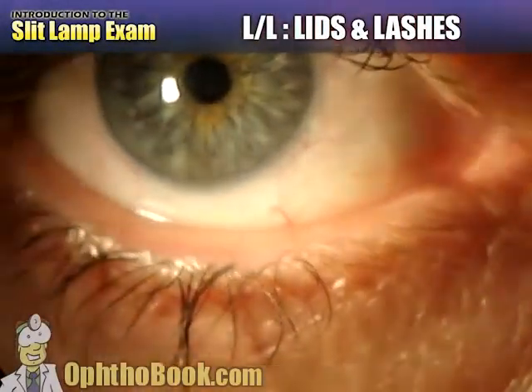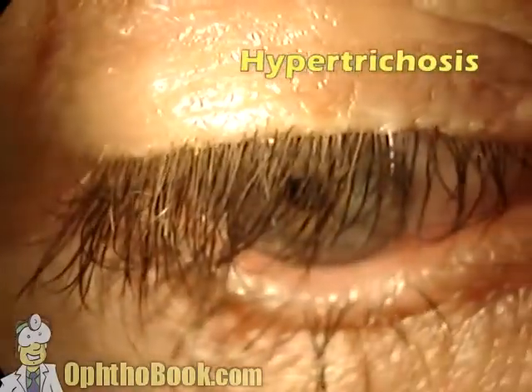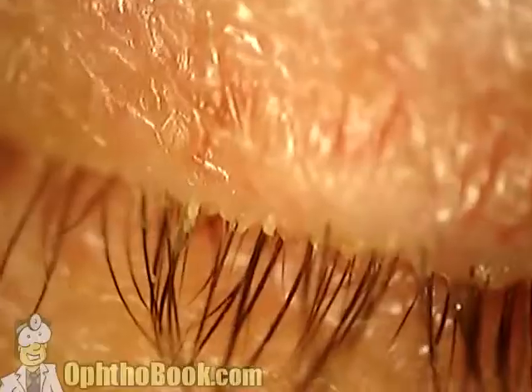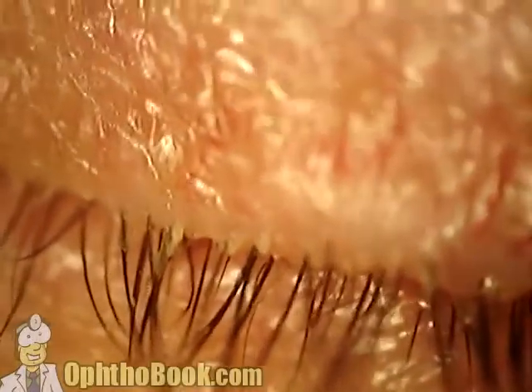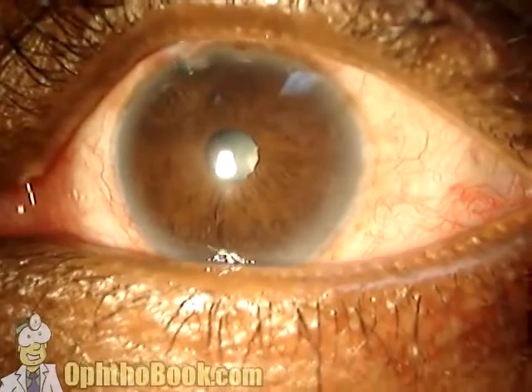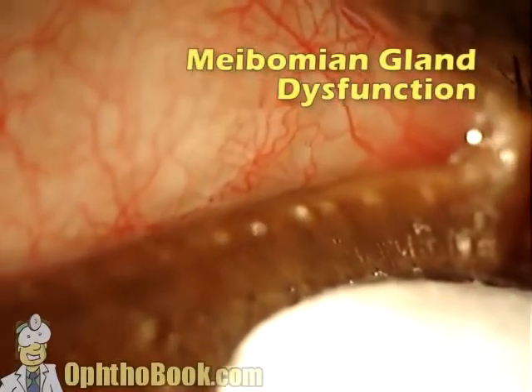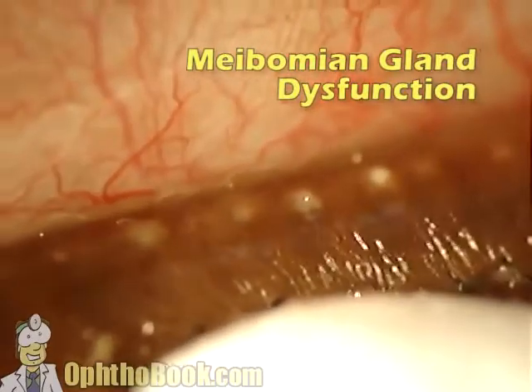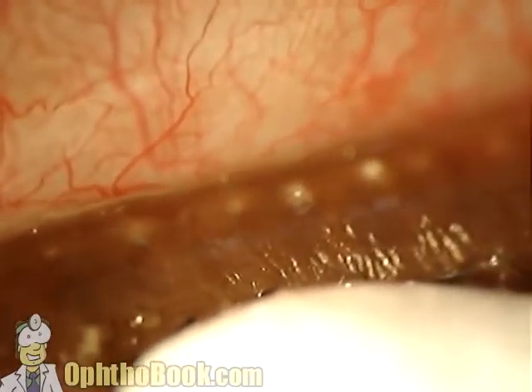At first glance, these lids and lashes look normal, but if you look at the sheer length of these lashes, this is a patient that's been on Xalatan for many years and has the lash growth that some people like. Collarettes, scurf, and junk on the base of the eyelashes. You see this with anterior blepharitis. This is a case more of a posterior blepharitis, where the meibomian glands become clogged up, and when we push with our Q-tip, you can see that whitish, oily material just kind of oozing out, causing a lot of issues.